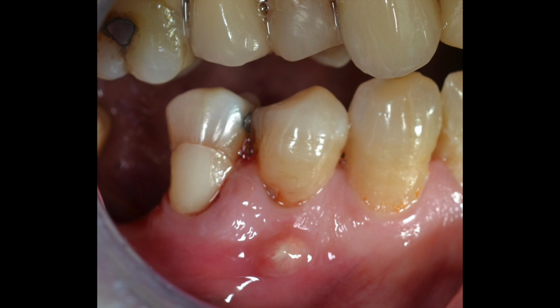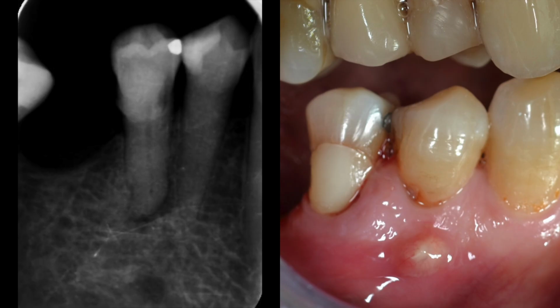Why trace a sinus tract? Because the sinus tract may not always appear next to the tooth with the infection. For example, here is a sinus tract adjacent to the first premolar. However, radiographic examination reveals that the second premolar has a periapical lesion. Tracing this sinus tract will show where the endodontic problem lies.